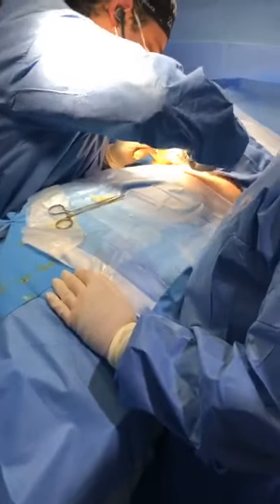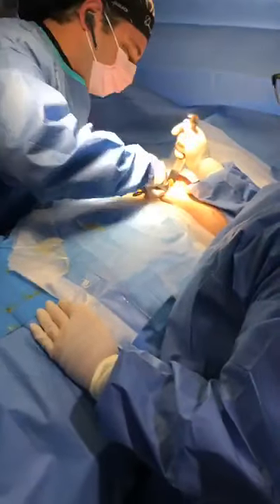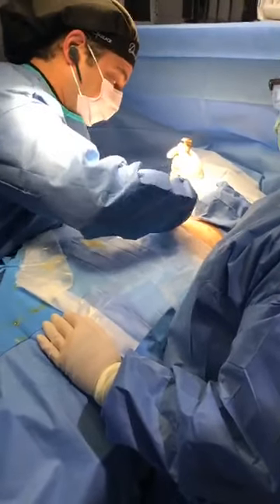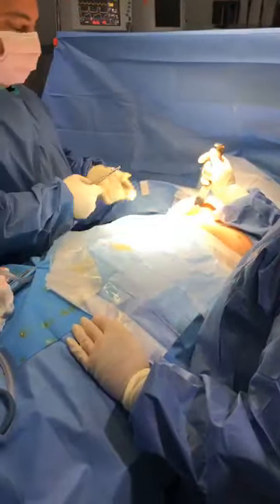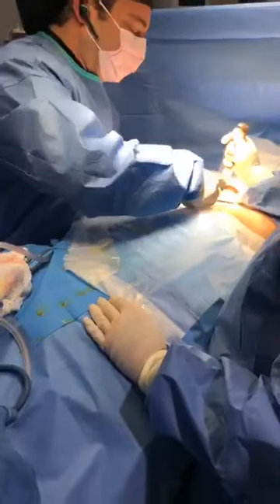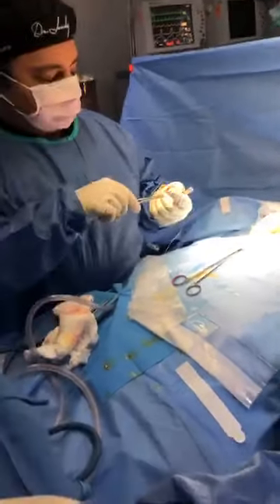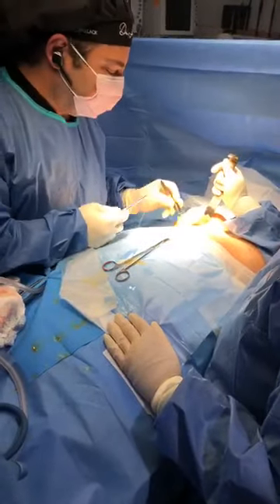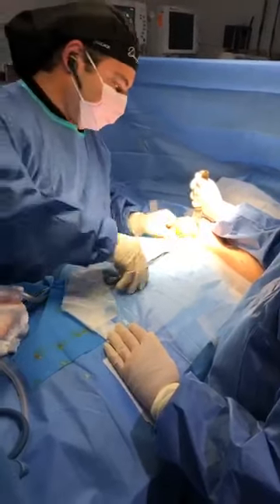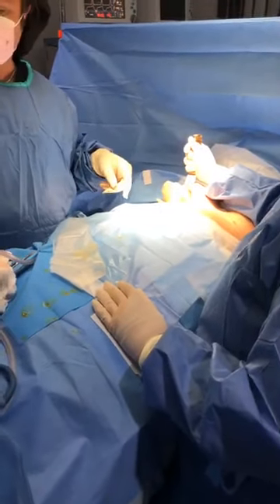Do you do any adjustment, like cutting, or anything? I used to put in Alloderm when I did breast recon. Sometimes when people come in with breast revisions I put these in, but I used Alloderm which was a skin substitute from dermis. This is made of a mesh of Vicryl. This recently came out. We like it because you don't use skin or pig, and this goes away — it gets incorporated into the tissue.